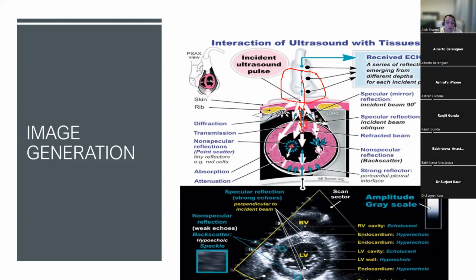More importantly, tissue density will change. If you look at this, this is the left ventricular cavity. At this particular point it has a ventricular wall with an outer wall and an inner wall, and it then has a very hypoechoic area, which is basically fluid.